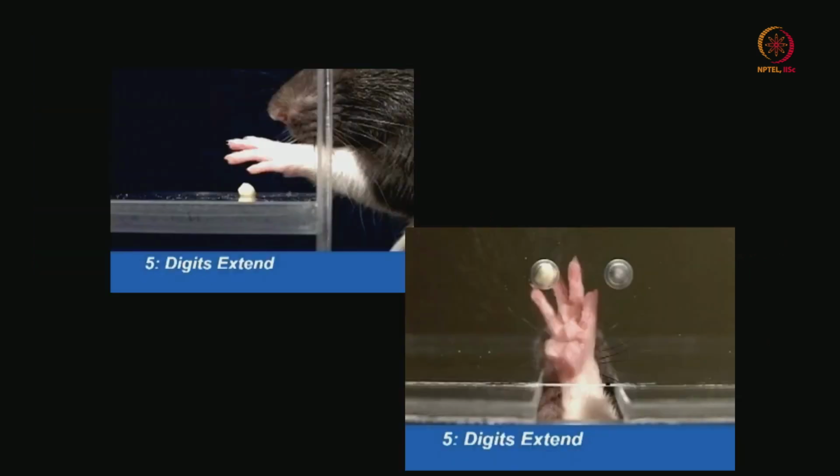So, once the initial advance is made, next, if you remember, the third step was digit semiflex. Now it is going to extend it. So that is the digit in full extension.